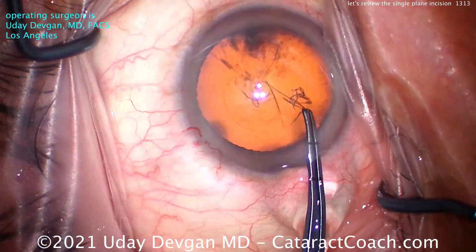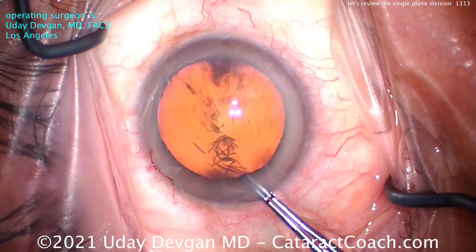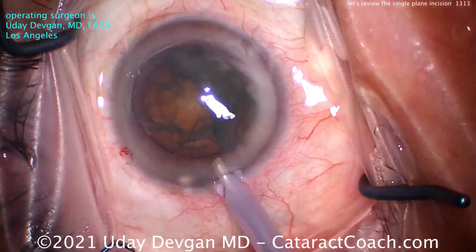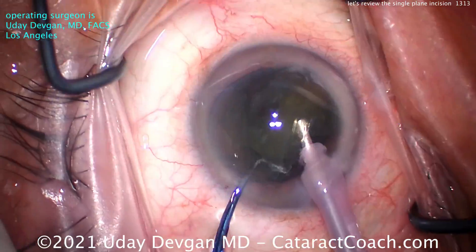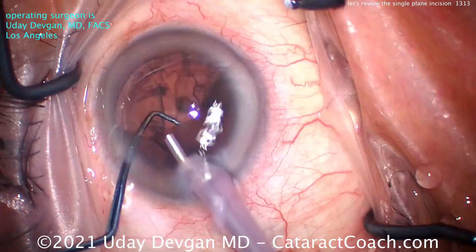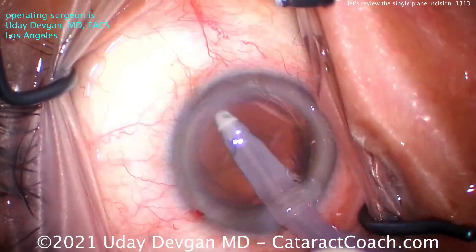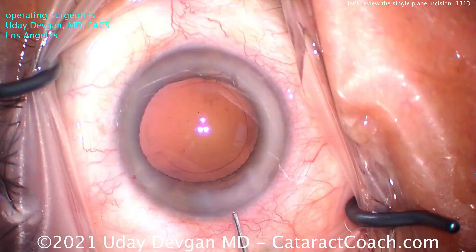Now the rest of the surgery — let's just fast forward the whole thing. The rest is straightforward. But that incision is such a critical part of the surgery. It's not only your signature, as we've talked about before, but it also determines how well the incision maintains the AC. If you have a leaky incision, the AC is unstable during cataract surgery. A bad incision induces more astigmatism, doesn't seal well, and creates a higher risk of endophthalmitis — you may have to put a suture in the eye.